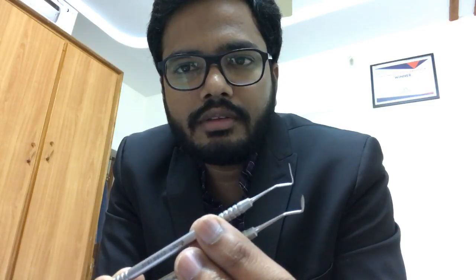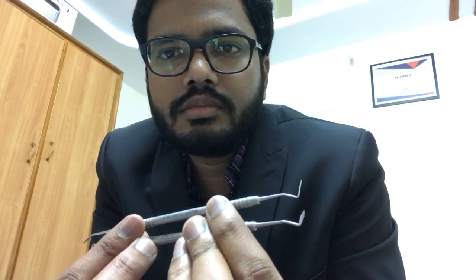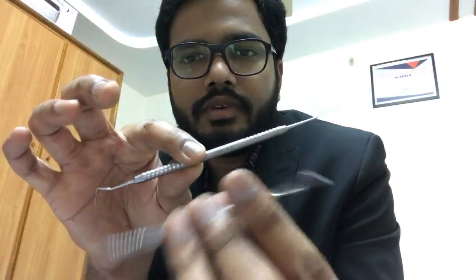Now, I'll show you these two instruments at a time because you need to differentiate which is Hollenbeck and which is Wards. Okay, the top one and the bottom one, which is Hollenbeck and which is Wards. So this is one end, and this is the other end. So based on this end, you can easily identify, right? Yeah, when you have this kind of a shape or orientation. So this is Wards. Yes, the top one is Wards carver and the bottom one is Hollenbeck.